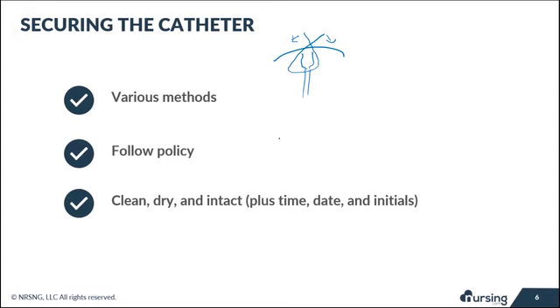There's a video that specifies a couple of different methods. This is just my personal preference. Now, also, one thing I want you to take into consideration is there may actually be a facility or unit policy that talks about this. So make sure that you know what that is, and that you adhere to it.